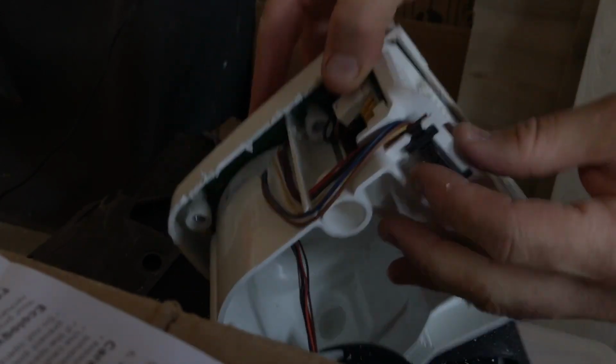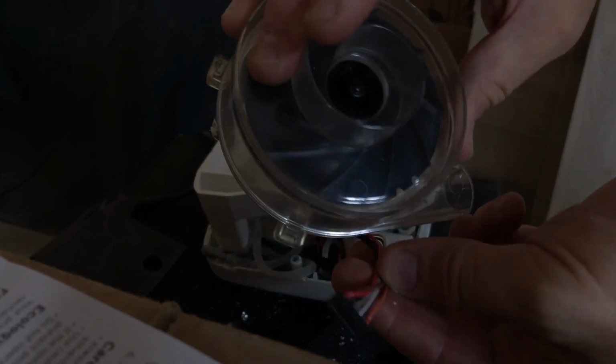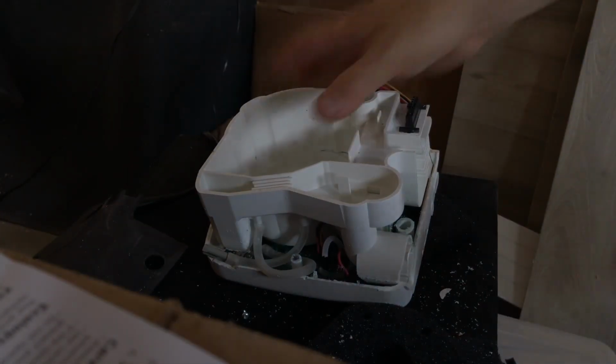Okay, let's see. There's an interface here. Now I happened to cut through the cabling here because I had to get through. You can see how deep the cuts are. Let's see what else is inside. If we can open the top. Right, anyway, the motor is out. Nice motor in there with a blower. And that's the connection there. Maybe worthwhile using. Okay, let's see what else we have in here.